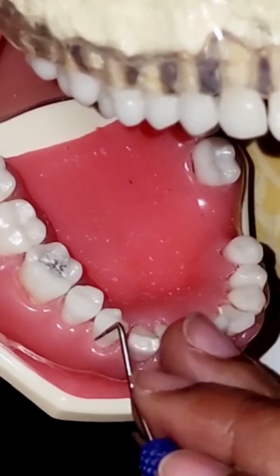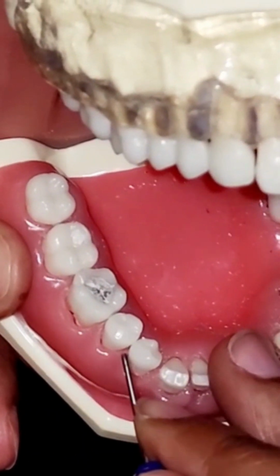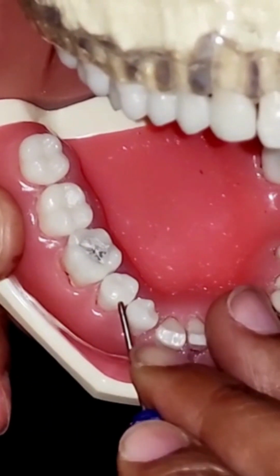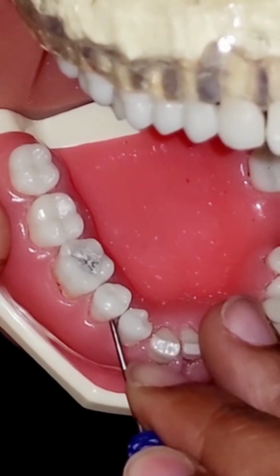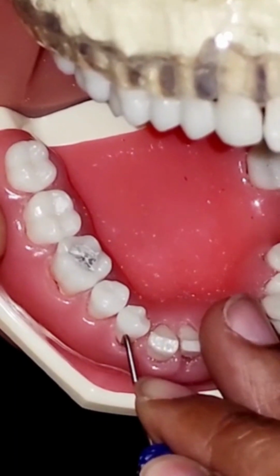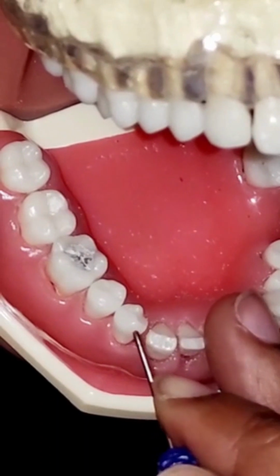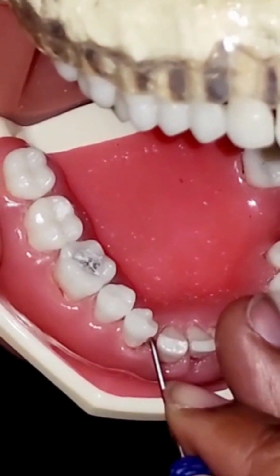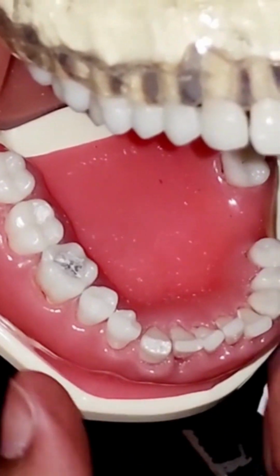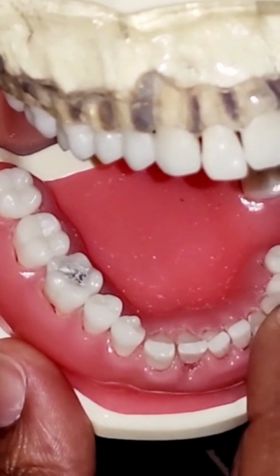Okay, his last premolar. Turn him slightly towards me. That is a 4. 5. 5. Okay, now I have to shift his head over.